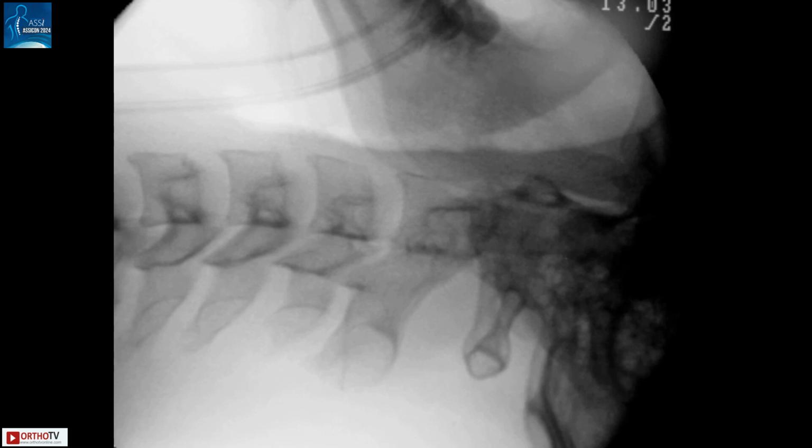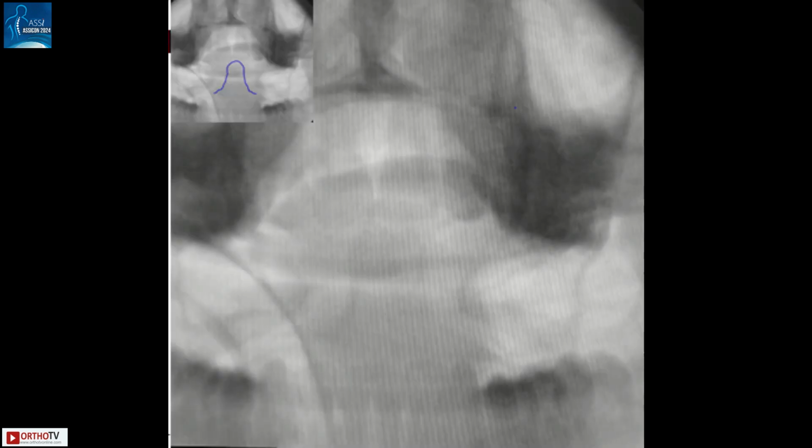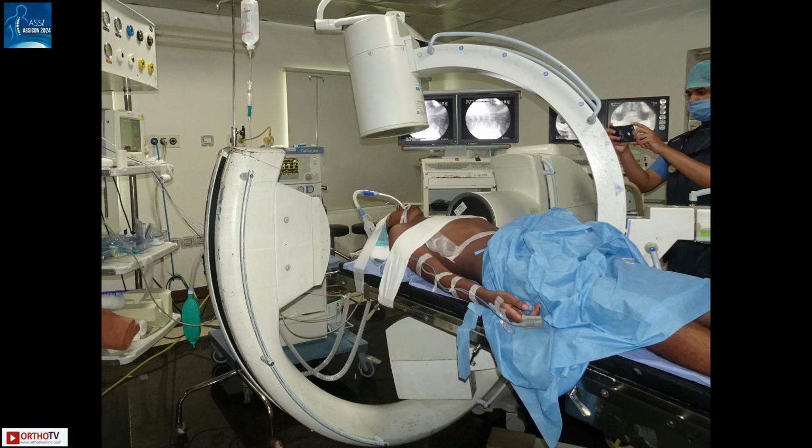What is very important is to get good radiographs. It's better to use two C-arms perpendicular to each other to get a good lateral view. Be sure that the fracture is reduced. Get a good open mouth view, which is very important. You should be able to appreciate the odontoid very clearly, and this should be the position of the C-arm. To aid in getting an open mouth view, you can use a cork, a retromolar placement of gauze, or a bronchoscope assisting device which helps to keep the mouth open, so that you can visualize the odontoid well in an open mouth view.